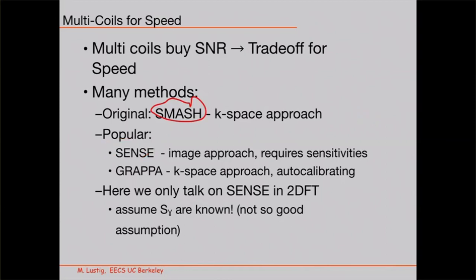So we kept to that convention. People have developed approaches to do this, I guess algorithms to do the unfolding, or basically the reconstruction. Some of them work just in K-space, some work in image space, and some work in a hybrid space, both K-space and image space.